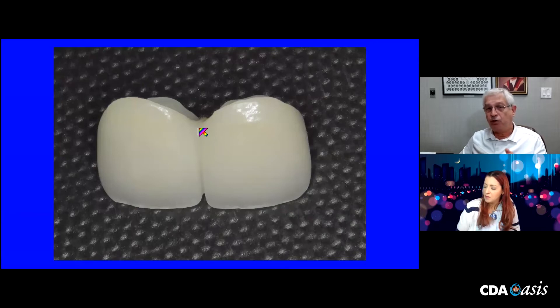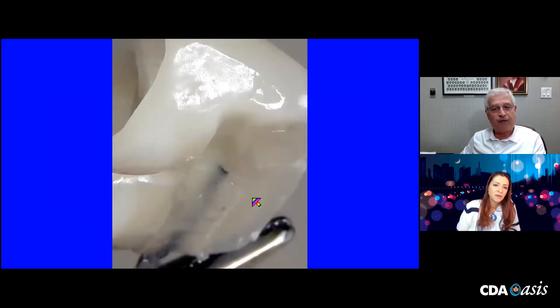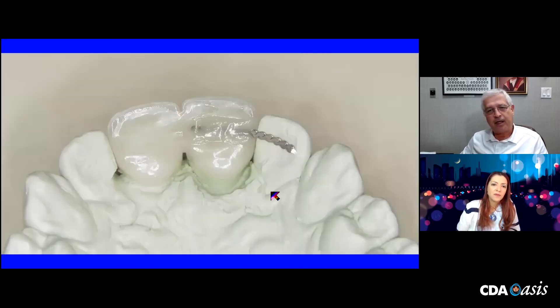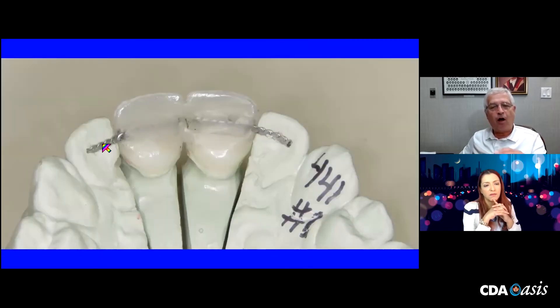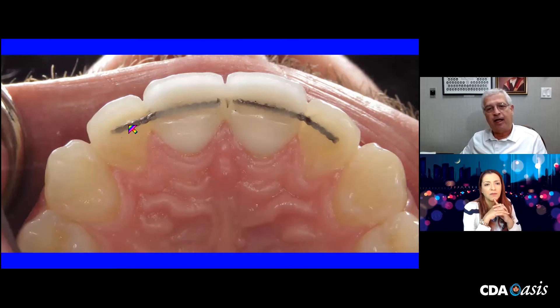There's no embrasure space here, so I did take the time using carborundum discs to refine this. But more importantly, I made sure — and I've done this in the past — to have a trough, a physical trough in the framework, so I can park some wire and then cover it with composite resin. Otherwise, it's difficult to have something stick to zirconia and overlaid porcelain. So here I've got one wire on the lingual surface covered in composite resin. There's that trough — I put the other wire in on the models, because it's easy to do this on the models, then take it to the mouth and just tack it on that side. It turned out very nicely and everybody was happy.